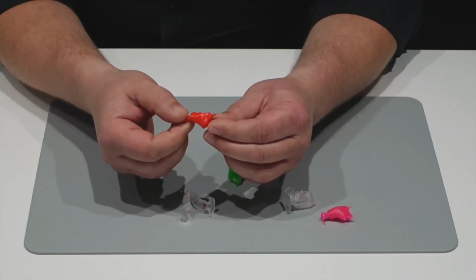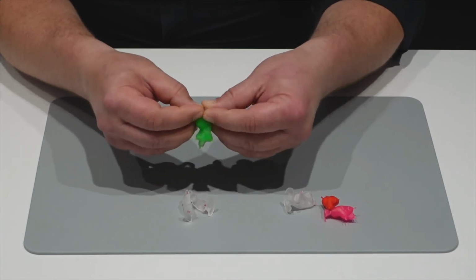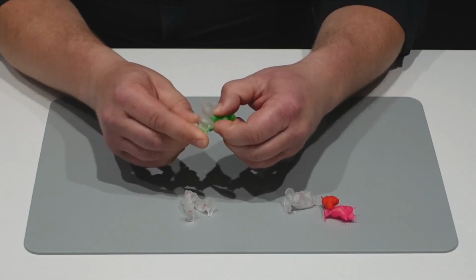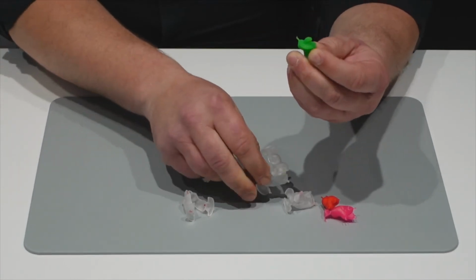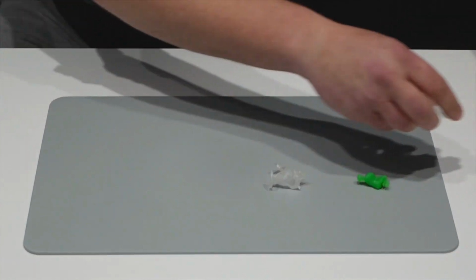It is completely final and ready to use. So once more, the process without any talking. You can see it's 1.0 seconds and then it's nearly ready for the finish. Okay.